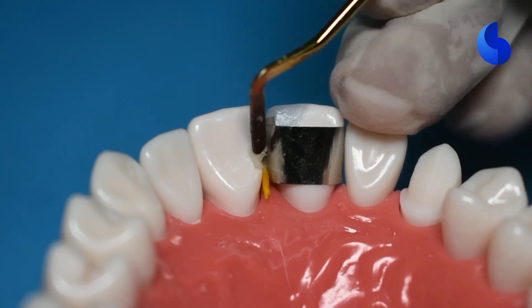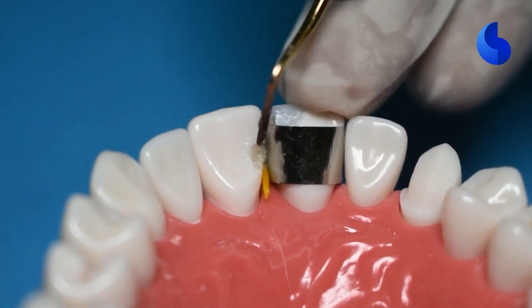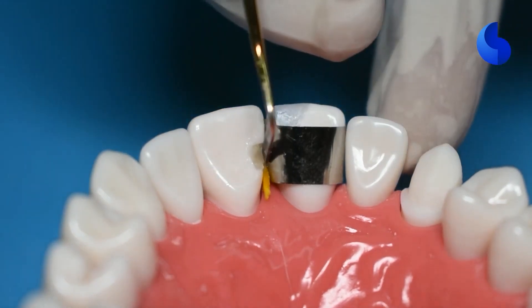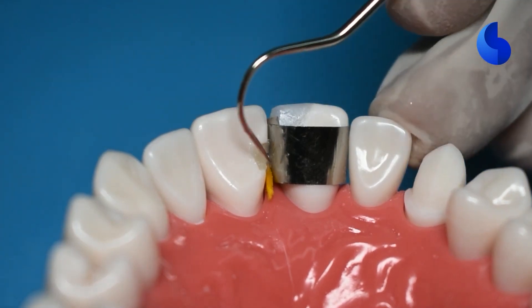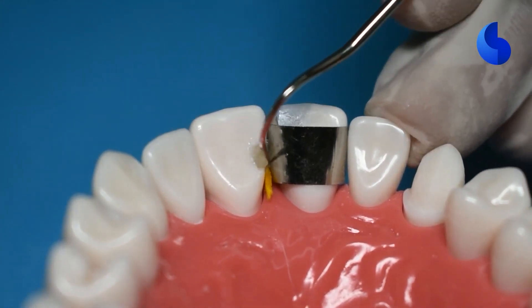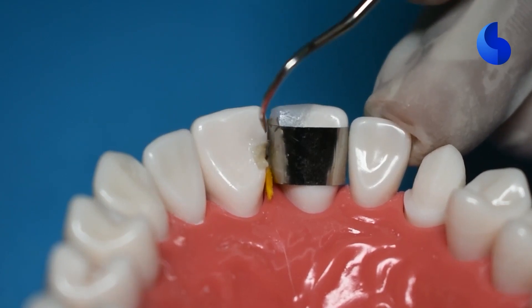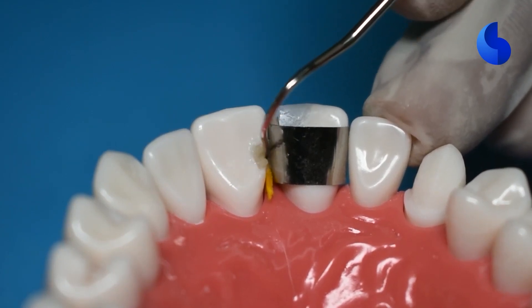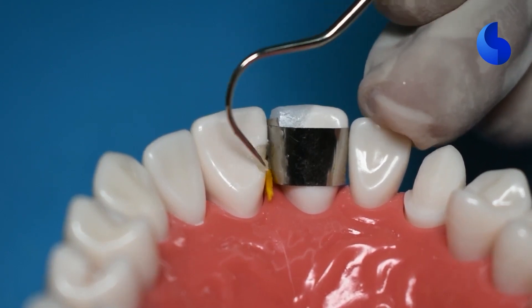Once you've cured it, take some composite and remember that this class 3 cavity is really tiny, so it only takes a little bit to get you there. Add that composite, condense it, and then you can use an explorer to remove any excess that could have flown in incisely or gingivally and also onto the lingual surface.